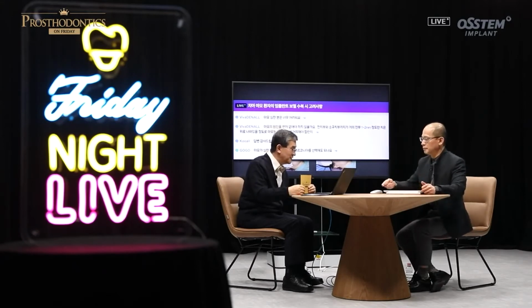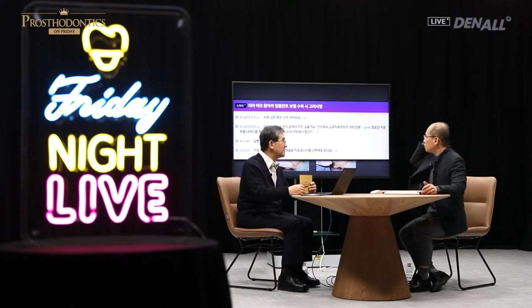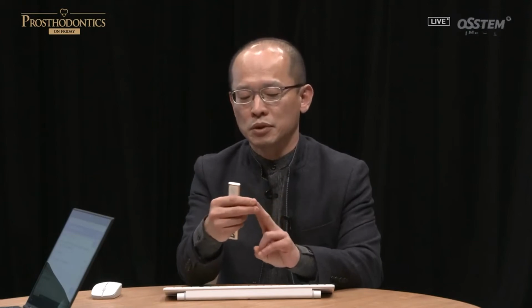Okay. If there's a lot of wear, can we use zirconia? Can you talk about materials later or now? I'll do it now. Now, I don't know what to say. Well, let's say it was experimental. There are two conditions I want to talk about. First, if it's full mouth rehabilitation, you always use gold because of the patient's comfort.